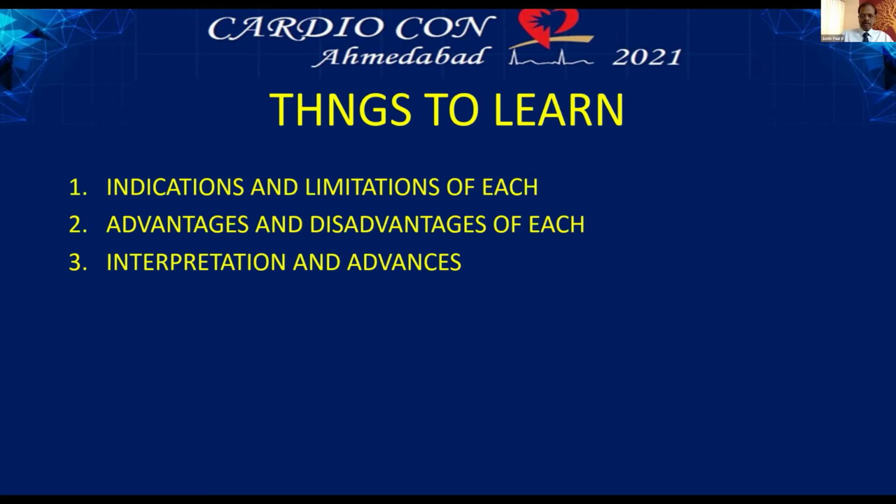You are muted, Dr. Joel. Yeah, can you hear me? Yeah, now we can hear you. Yeah, so complex cases, definitely imaging is a gold standard nowadays, because for bifurcation stents, we don't know whether it's apposed or not. So imaging is much needed, first thing.